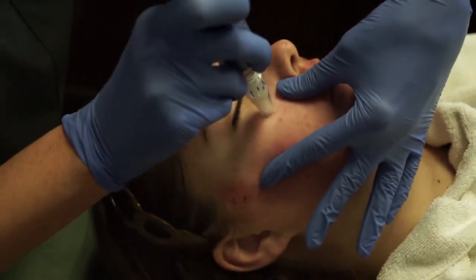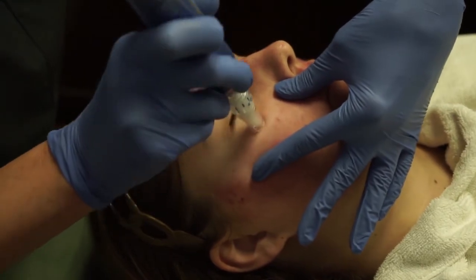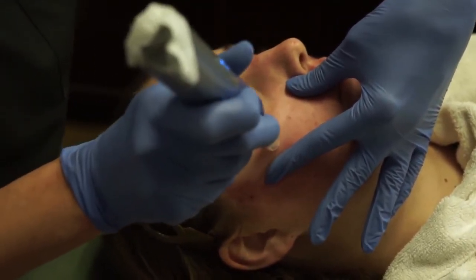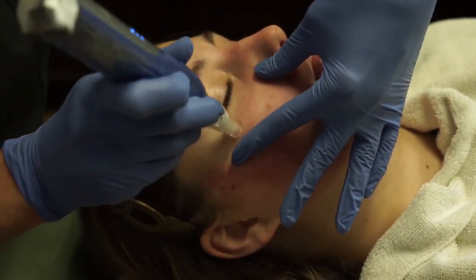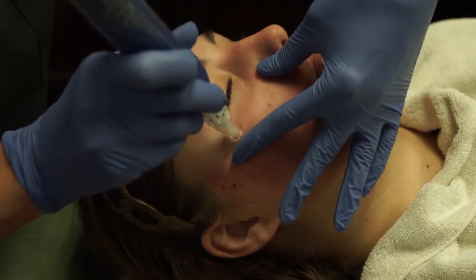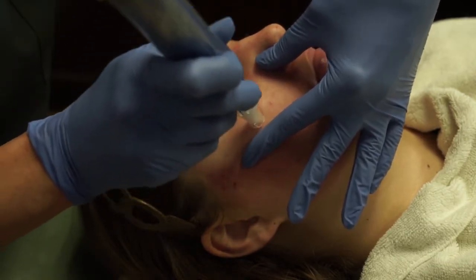So, starting at a depth of 0.25 millimeters, begin with slow passes on or outside of the orbital rim. Careful not to go inside the rim to the upper or lower eyelids. Check in with the patient for comfort during this part of the treatment.